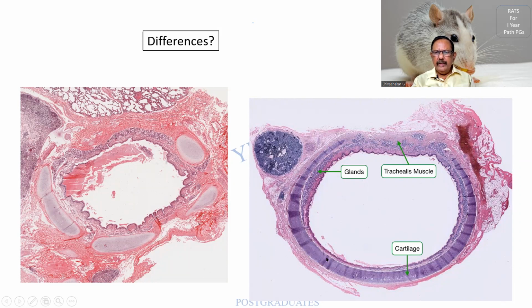This bluish color is always there for the cartilage or calcification, etc. So in the trachea, I'm finding a large ring of cartilage which is incomplete. If it is totally complete, then you and I cannot breathe. On the contrary here, I am finding bands of cartilage which are broken or intermittent. And there are other tissues, we will not go into it because the class for the day is cartilage.